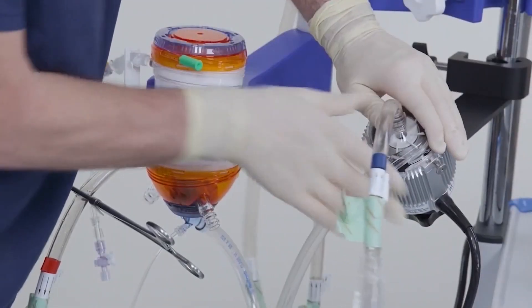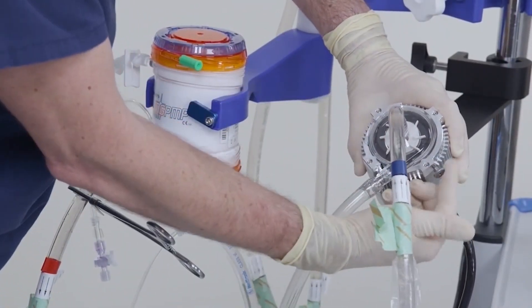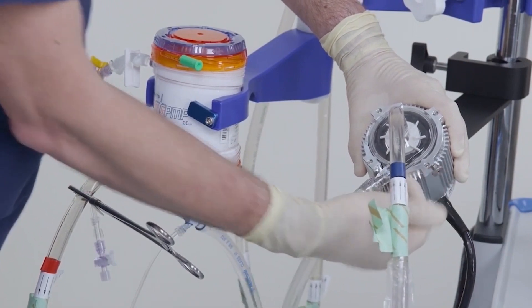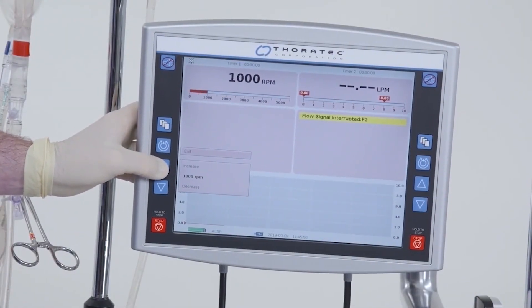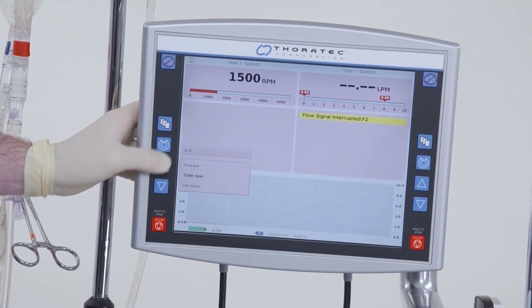Once the pump and tubing are free of air, place the pump back into the motor, securing it with the retaining screw. With the CentraMag console on, initiate flow by increasing the speed to 1500 RPM.